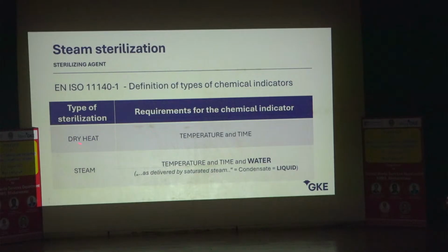It must not change color if there is not enough temperature, not enough time. Agree. And now I want to make an indicator for steam sterilization. Then the standard says, okay, your indicator is only allowed to change color when there is temperature and time and liquid water. Hey guys, you can sterilize with 134 degrees centigrade, but only if the surface of your instrument is wet during the holding time.